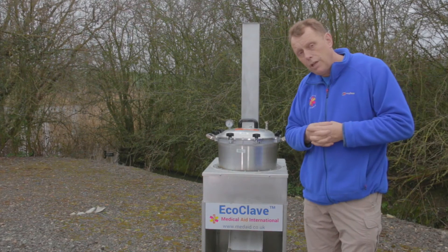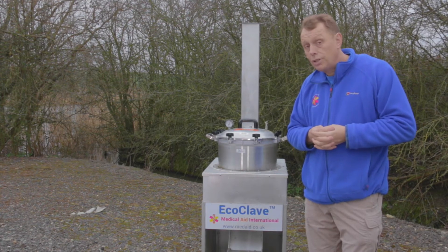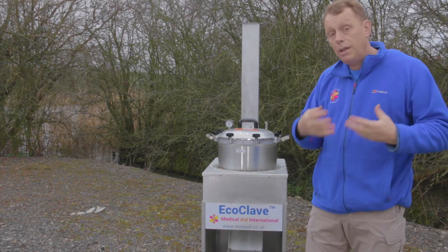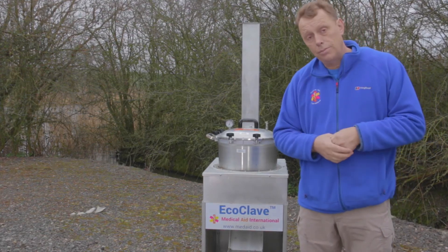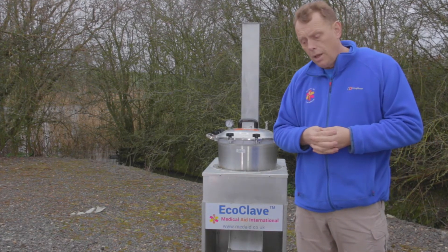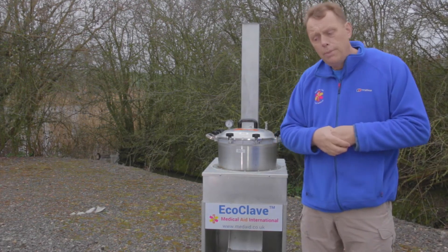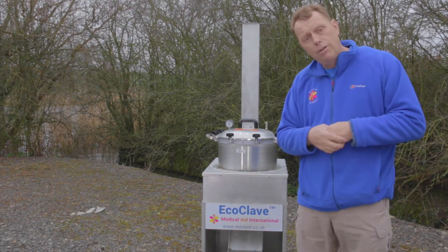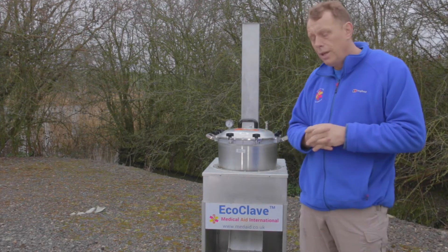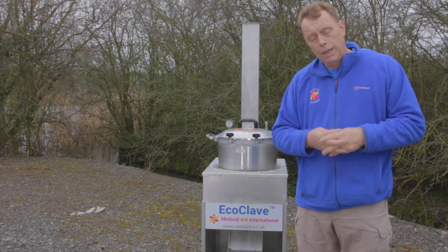As any healthcare professional working in the developing world will tell you, sterilisation in areas where there is no electricity or unreliable electricity is a massive problem. On many occasions you're lucky if instruments just get put in boiling water. It doesn't take much imagination — forceps or surgical instruments used in an HIV-infected wound being used on someone else without being properly sterilised in between. This device stops that happening. It is easy to use, safe to use, and uses minimal fuel, being economical.